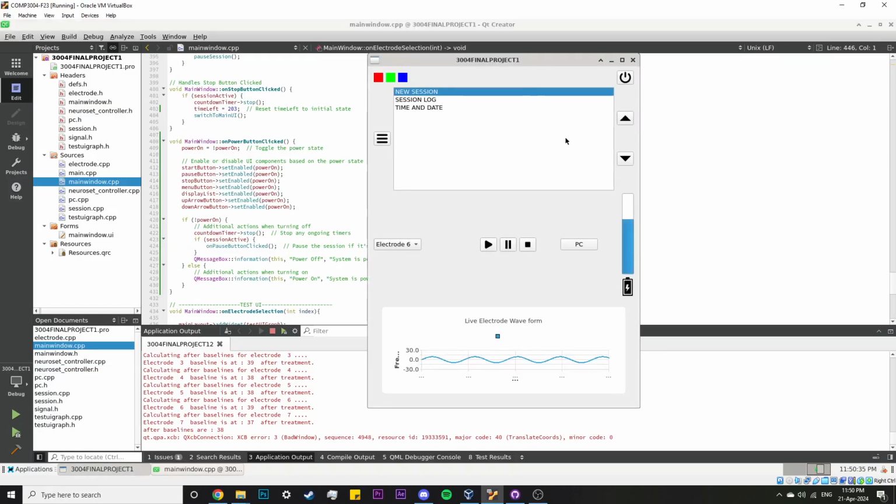As you can see, our app has multiple lights which signify different parts. What we care about is the red one, as it represents disconnected or low battery. Based on our use case, our app would continually monitor the connection between the electrodes and the device. The device would warn the user if disconnection is detected, which is shown through the red light at the top of our app. The user can reestablish the connection as the session is automatically updated. Then the device would store any session data and end the session if the connection is not made again.